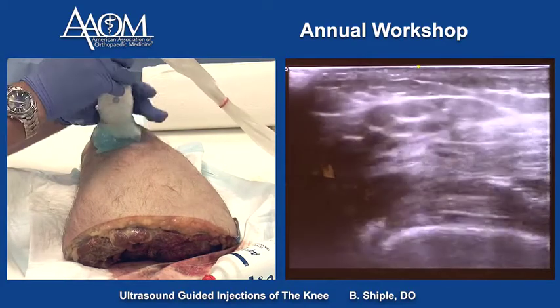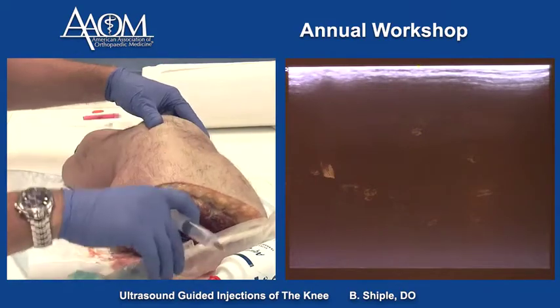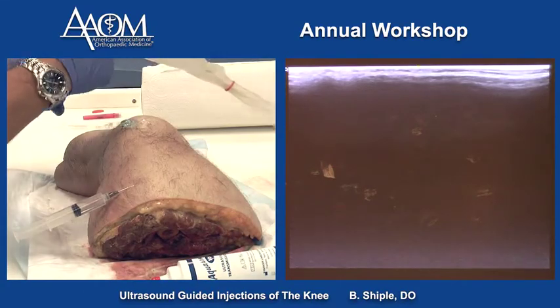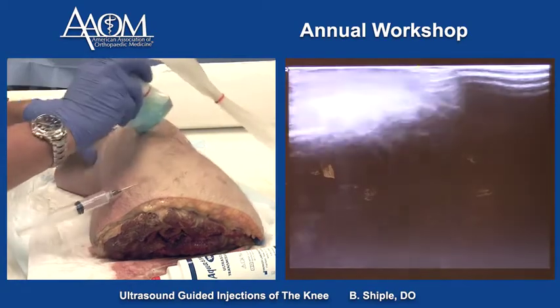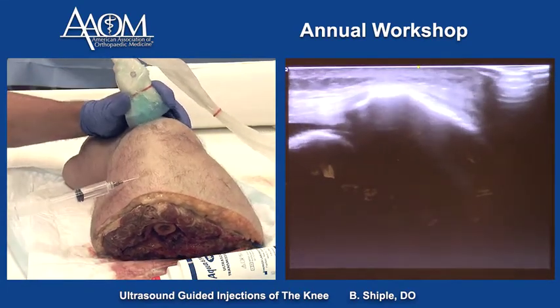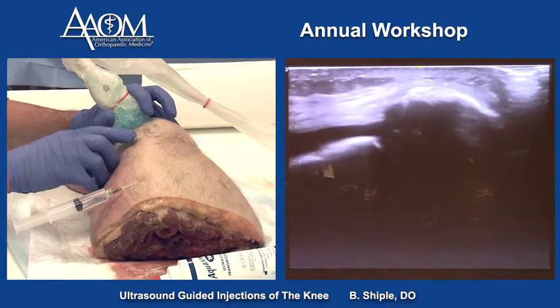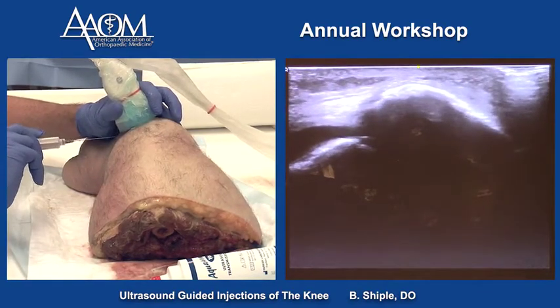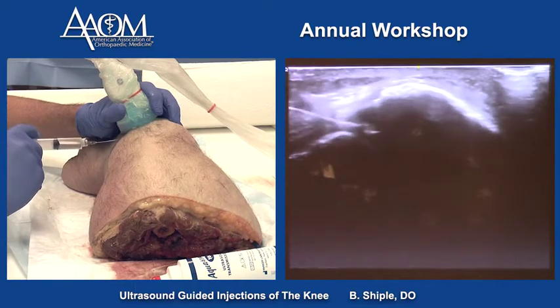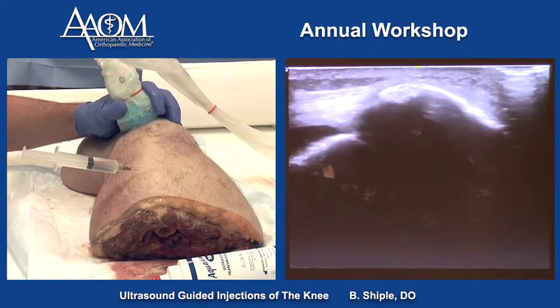The next technique is the modified Jackson technique using ultrasound. The patient is lying on their side. I would use this technique if the joint space in the suprapatellar pouch was just not cooperating. We put the probe over the lateral patellofemoral joint space, sublux the kneecap laterally — that opens up a potential joint space — then slide the needle underneath the probe. Now I'm in the joint, and we inject. That's a good fallback technique for a patient you're struggling to get into the suprapatellar pouch.